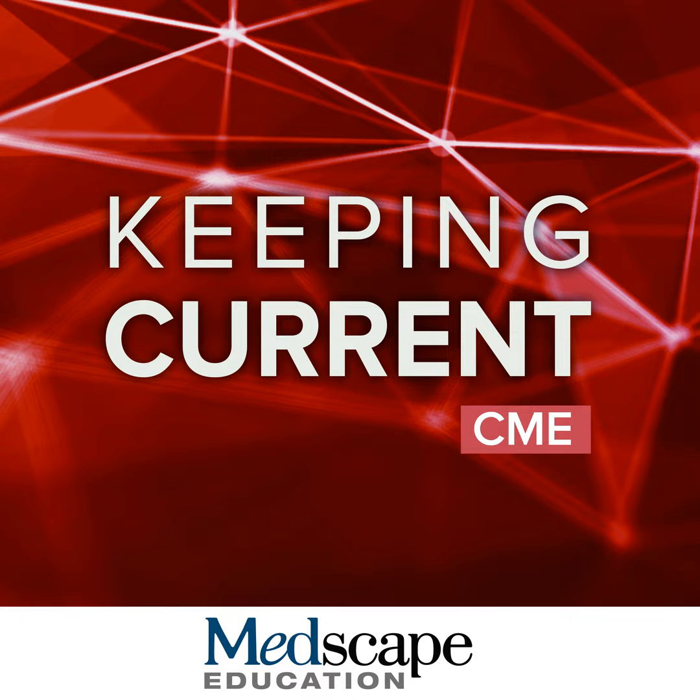And why does imaging come into this? Well, a key finding for all of these studies was target engagement was confirmed with amyloid PET. So this is an example from the aducanumab trial, a patient on placebo whose amyloid PET scan is positive and remains positive versus someone treated, and you can see the clearance of the amyloid.